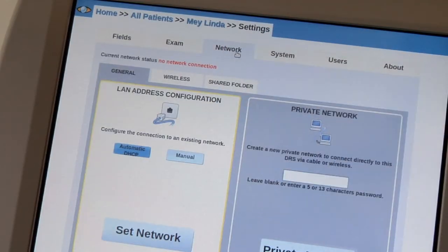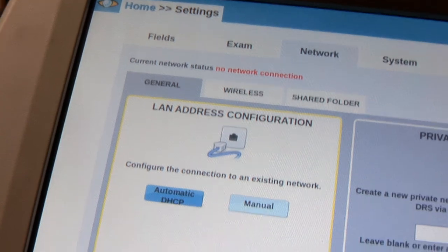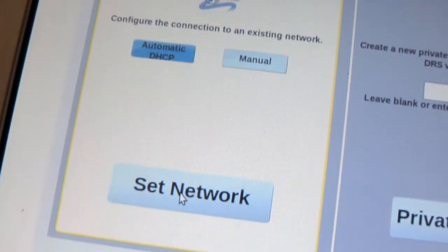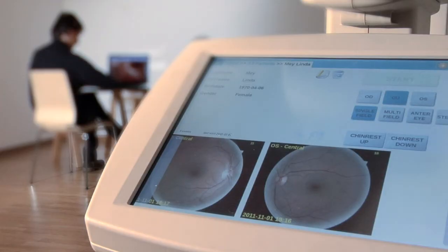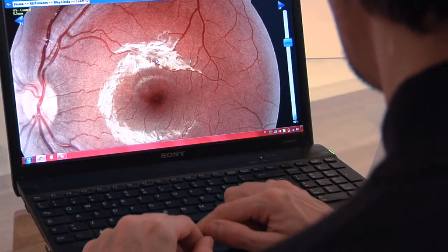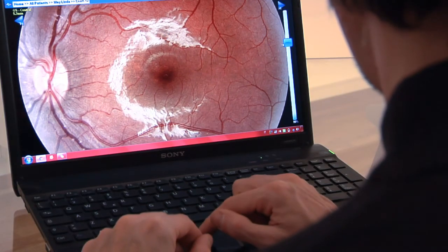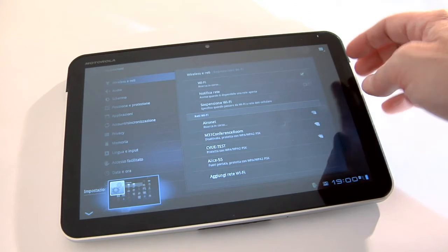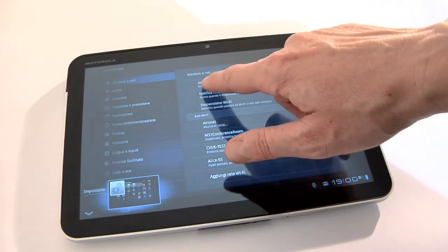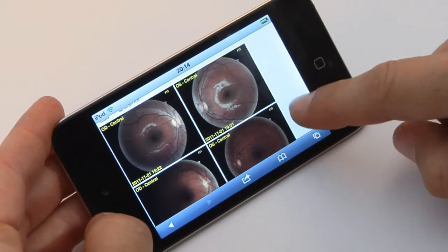The DRS is web-connected and the images can be viewed from any personal computer, inside or outside the examination room. You can also view the images from an iPad, from anywhere in the office or even remotely.